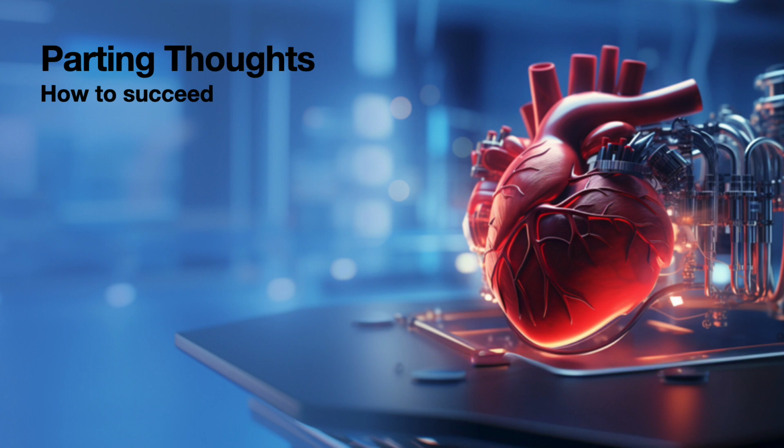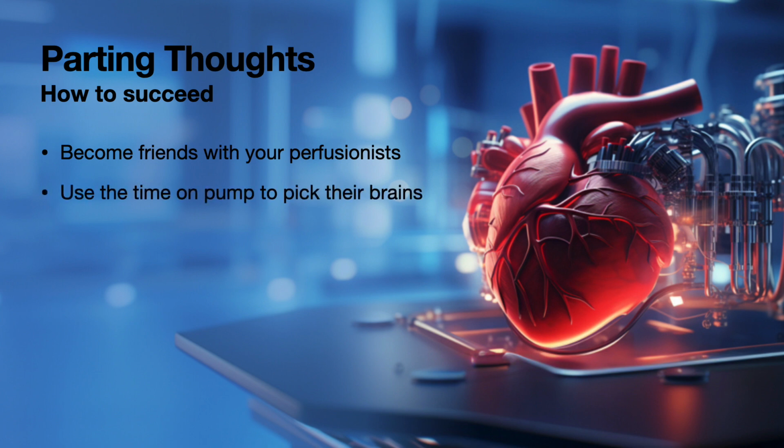Some final thoughts on how to successfully navigate a pump run. Get to know your perfusionist by name. Establishing rapport will go a long way to smooth operation and cooperation between perfusion and anesthesiology. It's worth checking in with your perfusionist periodically during the pump run to ensure that things are going smoothly from their perspective. They can clue you into evolving problems, which gives you an opportunity to intervene before they compromise the patient's safety.